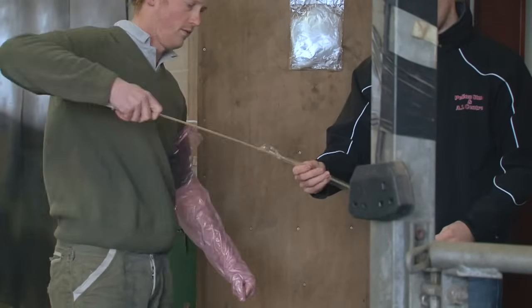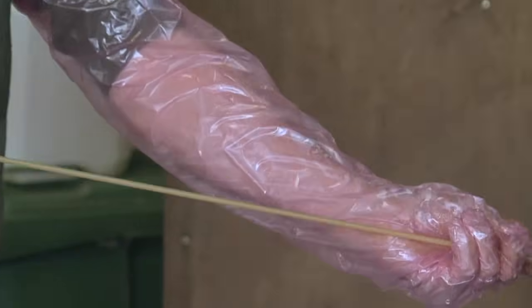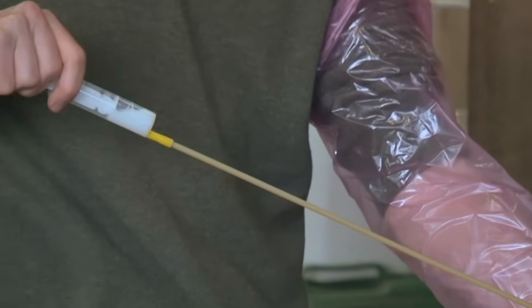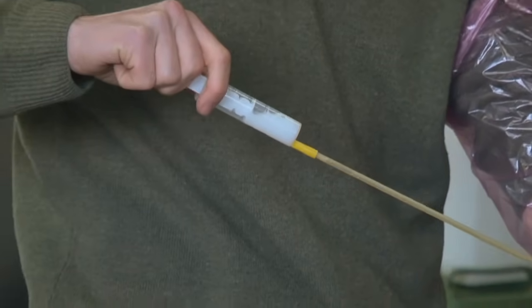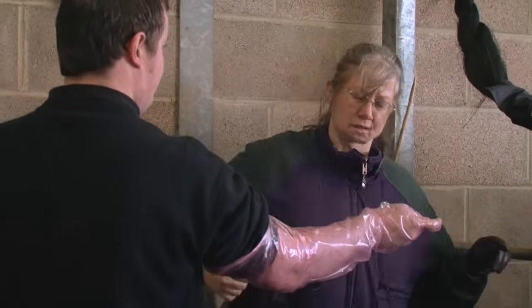The syringe containing semen is attached to the catheter, which is then withdrawn from the packaging carefully. 5ml of air are drawn into the syringe and the semen is then pushed to the end of the catheter. Non-spermicidal lubricant is liberally applied to the back of the gloved hand and forearm.